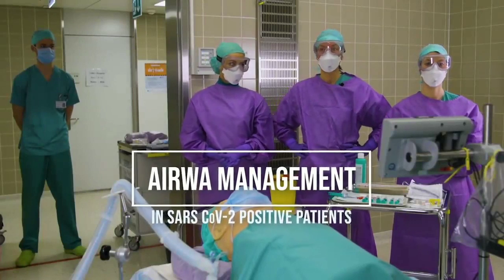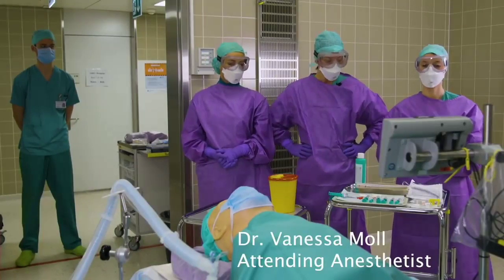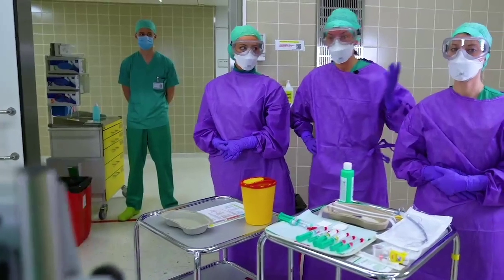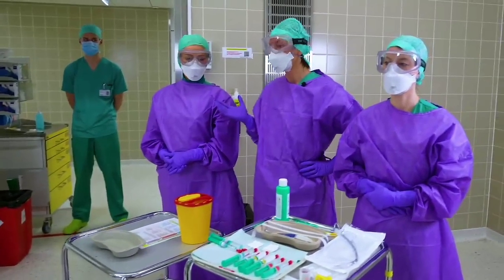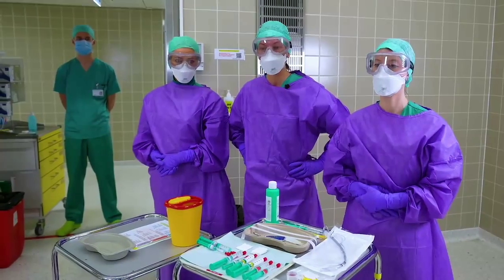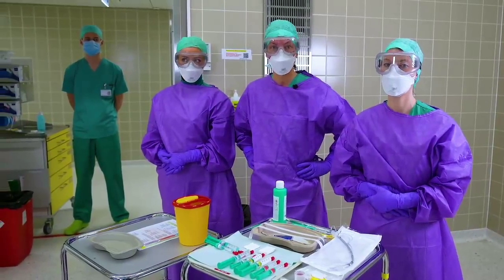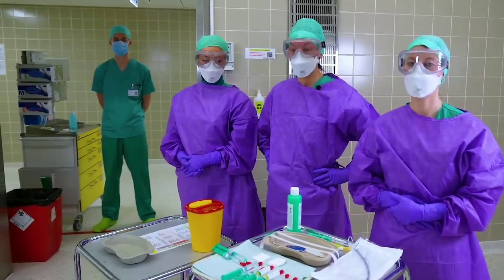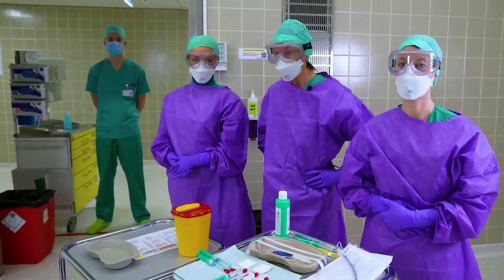We are from the Institute of Anesthesiology at the University of Zurich. My name is Vanessa Moll, I'm an attending here. Larissa is a resident and Manila is an anesthesia assistant. We are here today to introduce our airway management concept for COVID-19 positive patients at our university hospital.